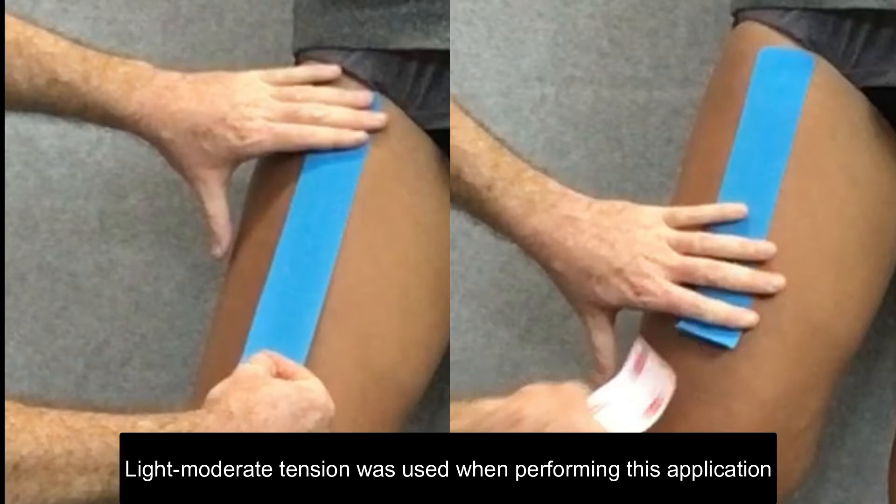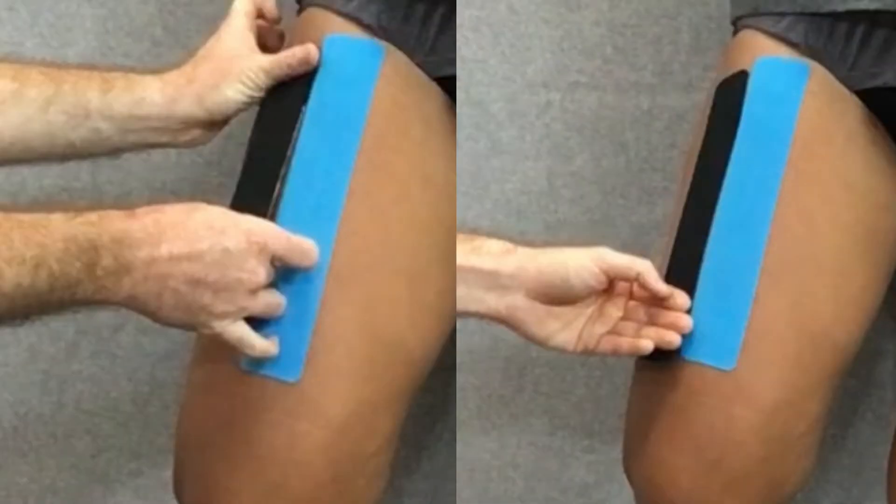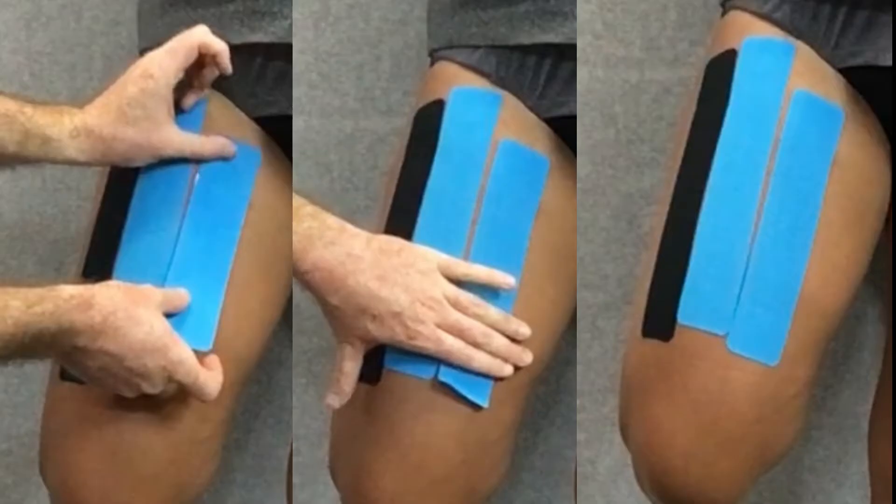We're going to take the second strip, tear the paper backing five centimeters from one end, and apply the base just outside of where we started the first strip. Then we run that one down the thigh with paper-off tension as well, ending with no tension on the skin just outside of the last strip.